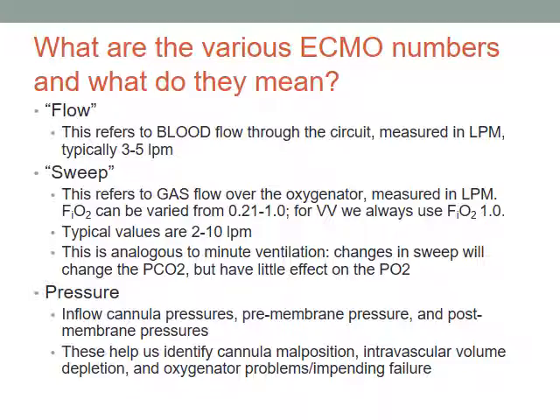But if I then do it the other way around and start showing you a bunch of circuit stuff, we can't even talk about it without knowing what these are. So there's a chicken and the egg problem. So I'm gonna tell you right off the bat, ECMO is incredibly complicated. The first time we did one of these, none of us knew what we were doing.